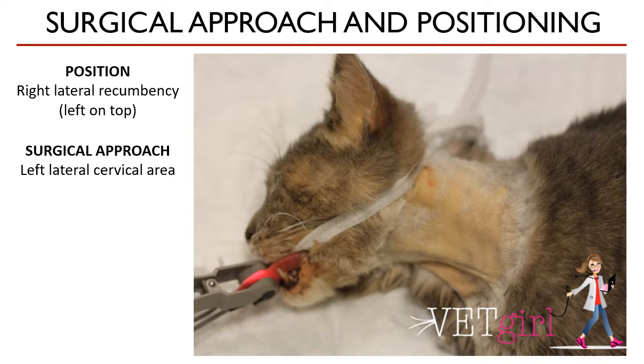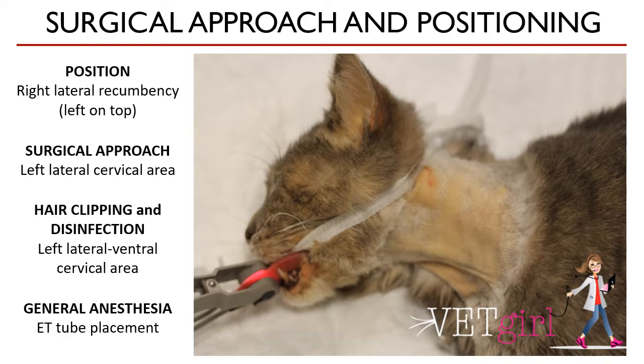Now, why the need for general anesthesia? The procedure does not take longer than 30 minutes, so why not just do it with mild sedation? The procedure may not take long, but you need to minimize the risk of the activation of the gag reflex when the tube or the instruments pass through the pharynx. Pharyngeal stimulation causes patients to vomit, awake, or bite reflexively.